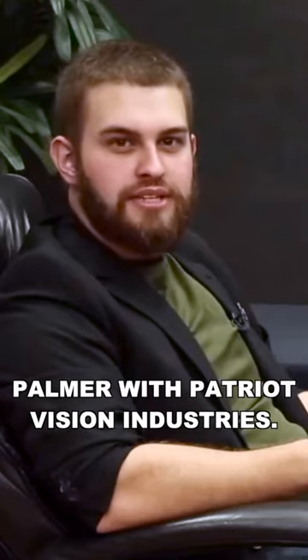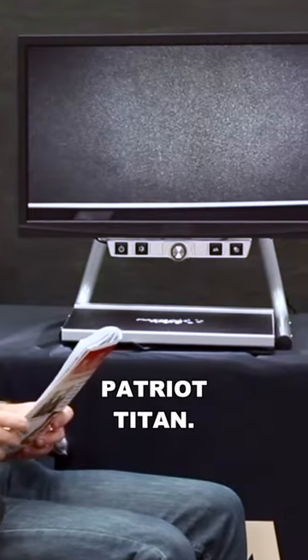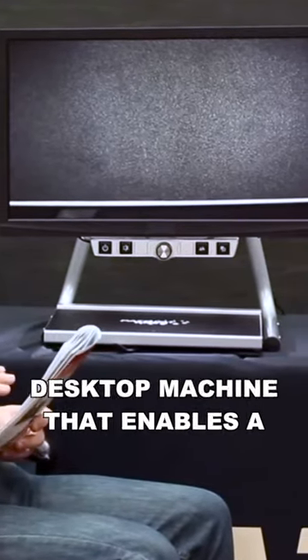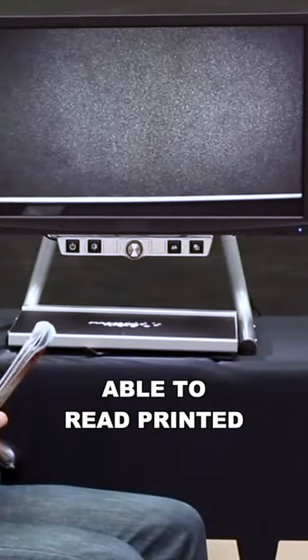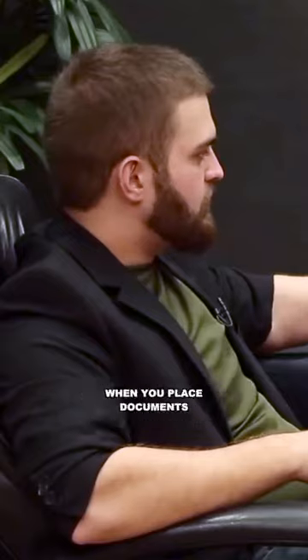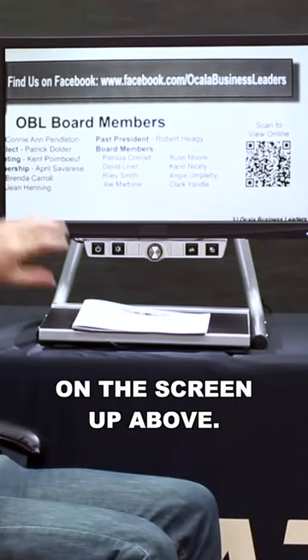Hi, my name is Charles Palmer with Patriot Vision Industries. Today we're going to go over a product called the Patriot Titan. This machine is a desktop machine that enables a legally blind person to be able to read printed material again. The way it works is when you place documents underneath on the tray, you're going to be able to see the image magnified on the screen up above.